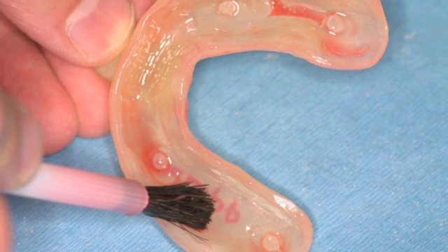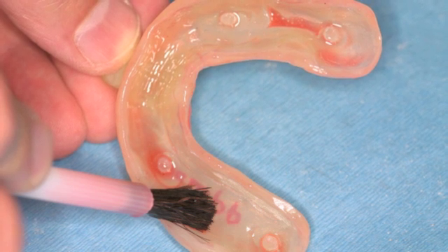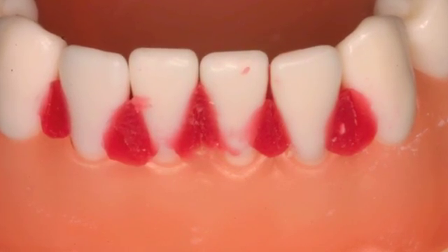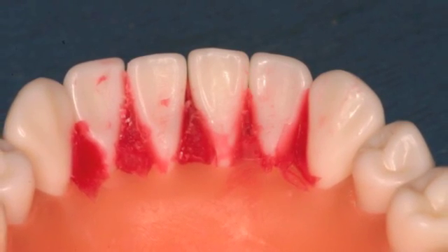Paint adhesive on the inner surface of the custom tray and on the outer borders of the tray. On the dentiform and in certain clinical situations, block out undercuts with an appropriate material.